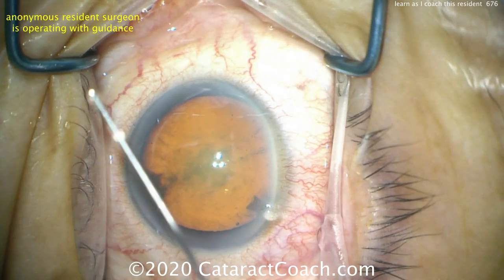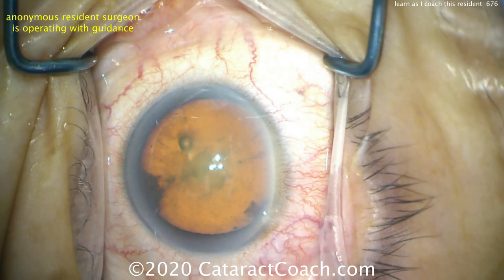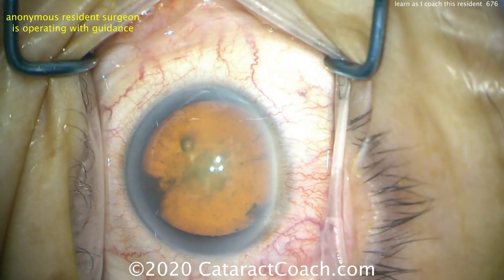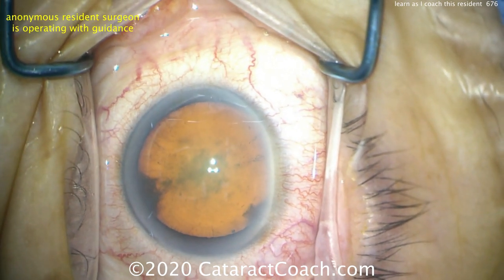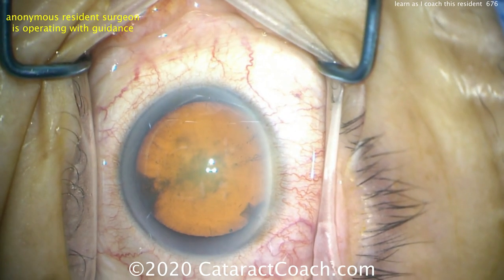We want a physiologic pressure. If the pressure's too high in the eye, the incision will tend to be short. If the pressure's too low, then the incision will tend to have too long of a tunnel length. So if that's a good pressure, let's put some water here — balance salt solution on that cornea — and now ready for the main incision.